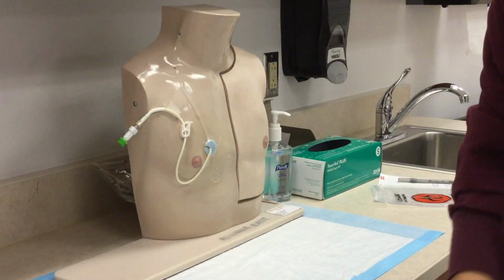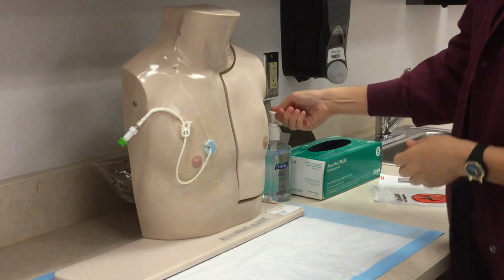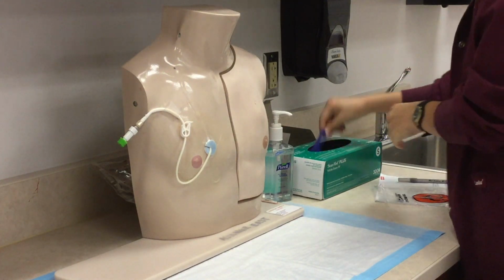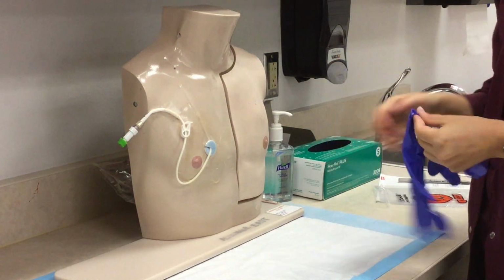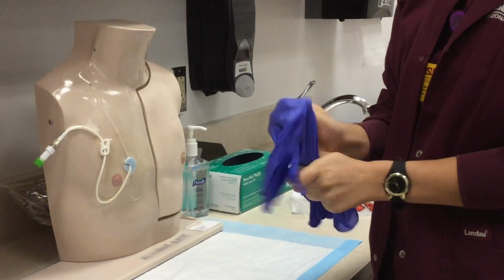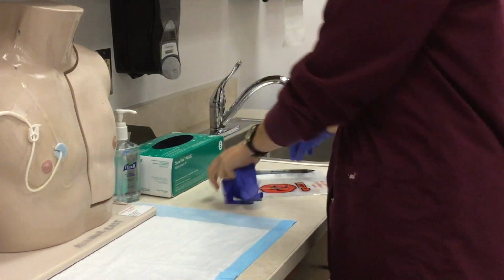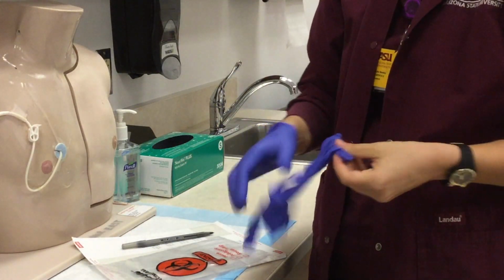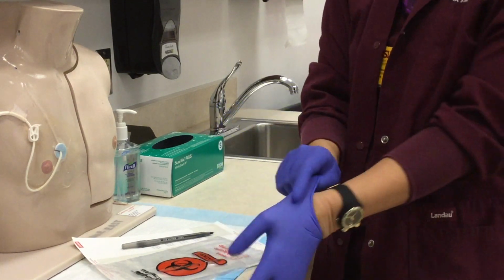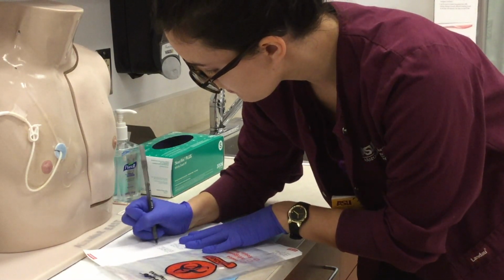Remove gloves, clean hands, and don clean gloves. Label the blood specimen with the patient's information, remembering to add your initials and the date and time the sample was obtained. Place in a biohazard bag and send to the lab immediately.